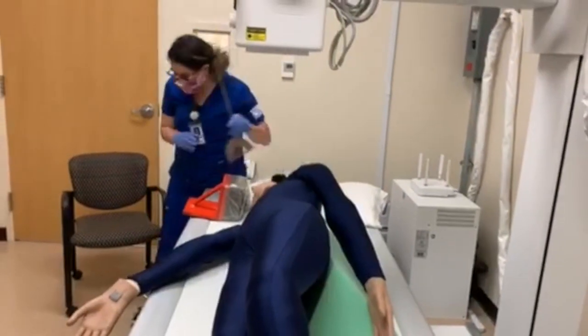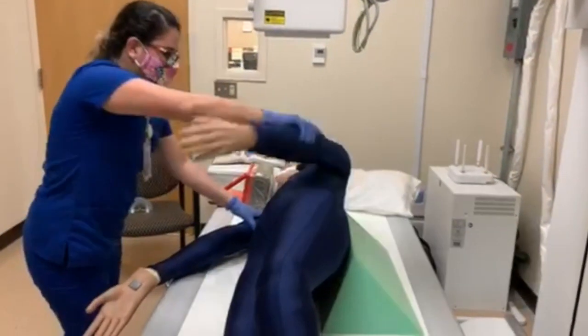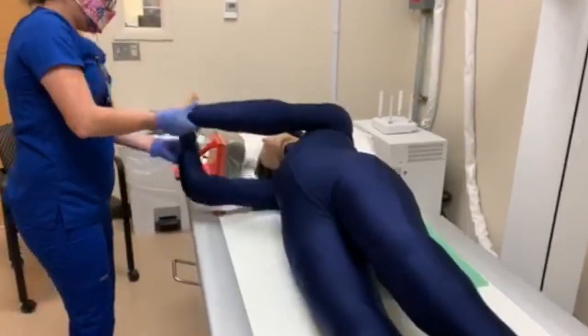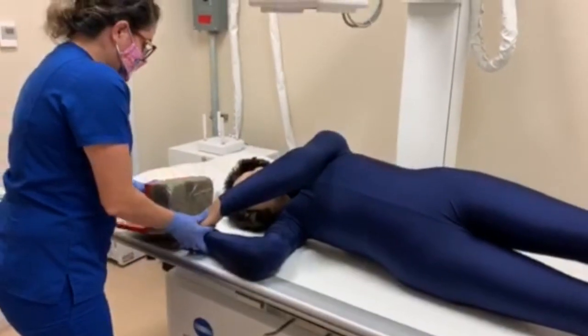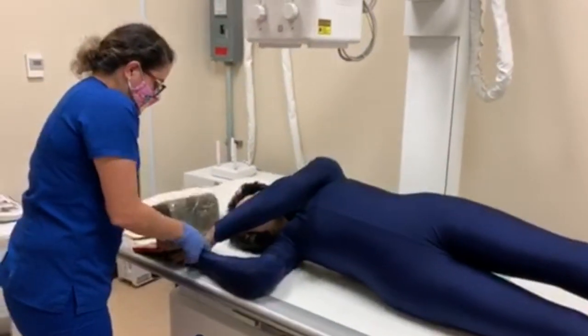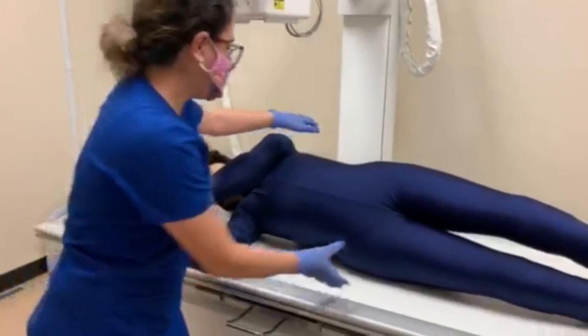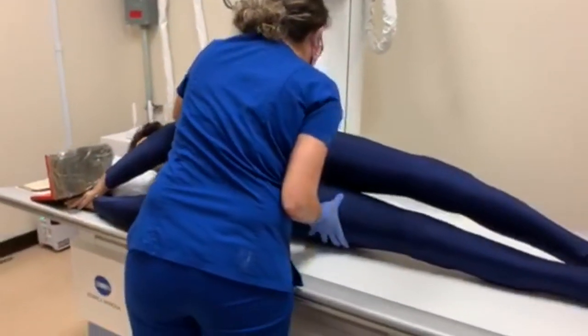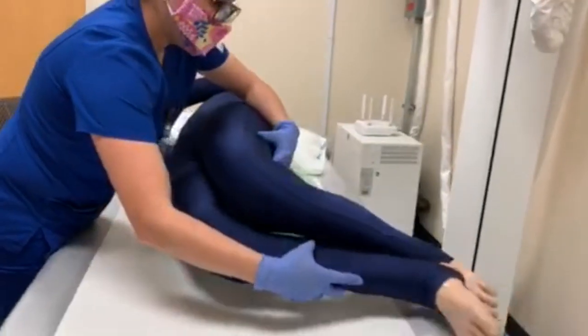About a 20-degree angle right there. I'm going to bring Molly's arms up into the praying position again, and I'm going to use a weight to hold her down. Make sure her body is perfectly straight with the table. She's going to flex her knees again.